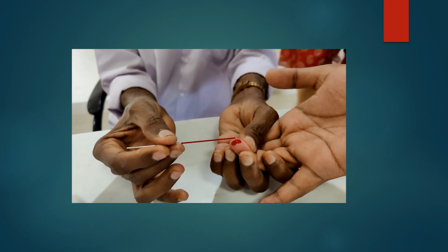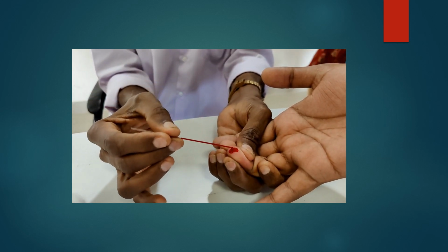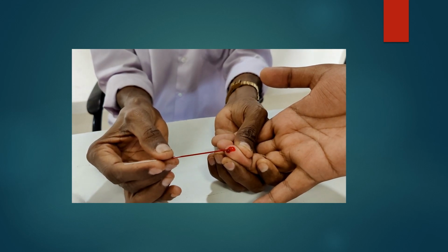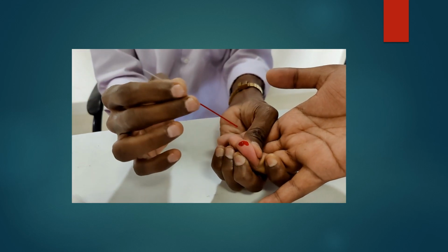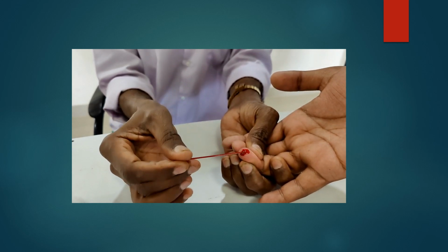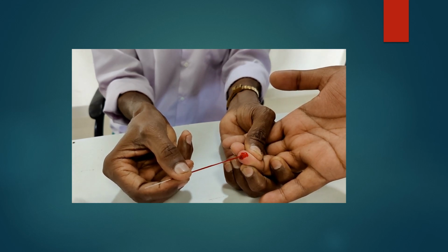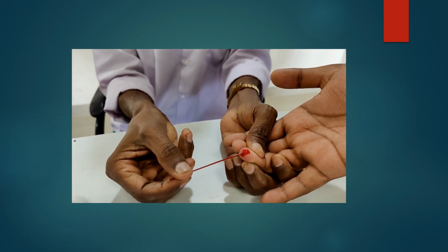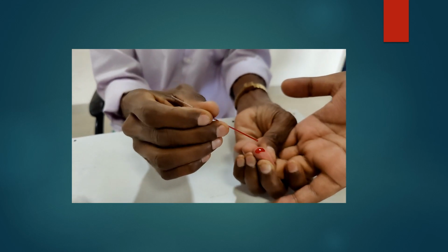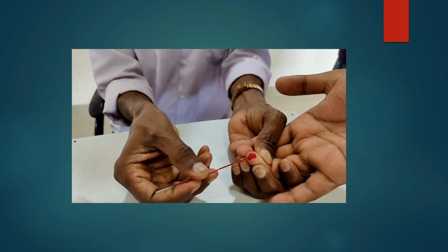See, like this you have to fill the capillary tube fully. And don't forget to start your stopwatch, okay, at the 0 second, which is known as 0 time. And after the capillary tube is fully filled, hold it in between the palms of the hand, okay, to give the body temperature. Let's look at this video.